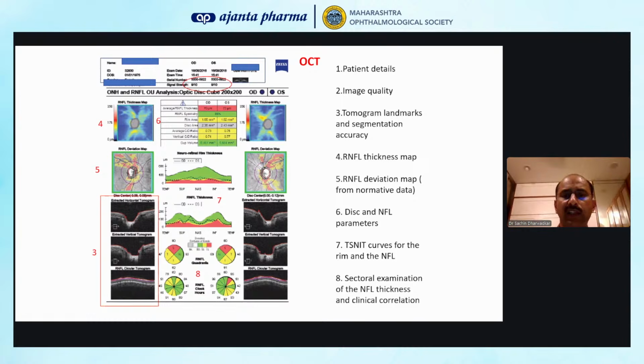So it is very important that you go in a systematic fashion, but obviously without seeing these qualities, do not even look at the central tables. That is the bottom line that you can take from this slide.